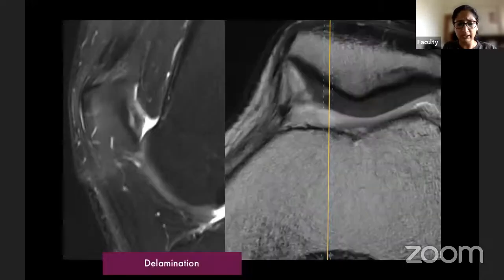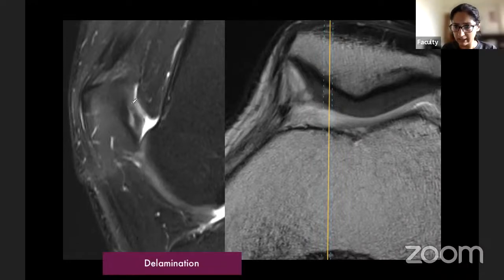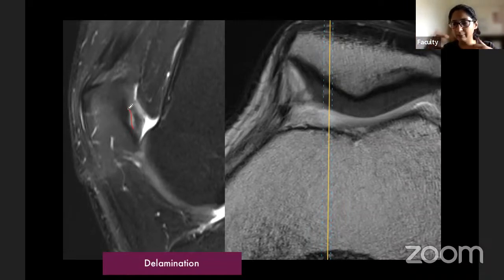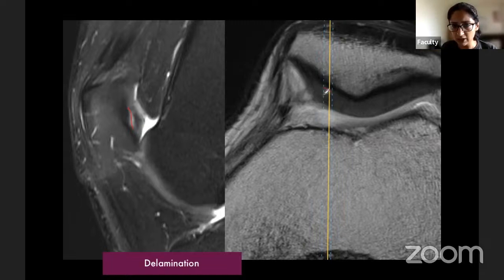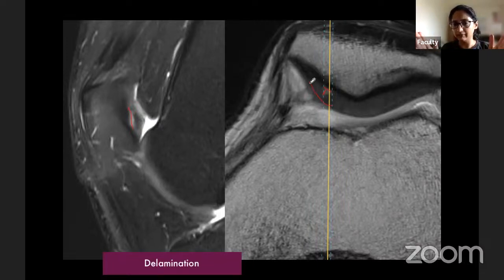Delamination: you see the overlying articular cartilage and deep to it a bright zone at the radial zone — the most common area for delamination by shearing forces. This is also called radial zone shearing. The bright signal tracks upward but the surface remains preserved. This can happen acutely at the soft-to-harder tissue junction where shear forces are maximal.